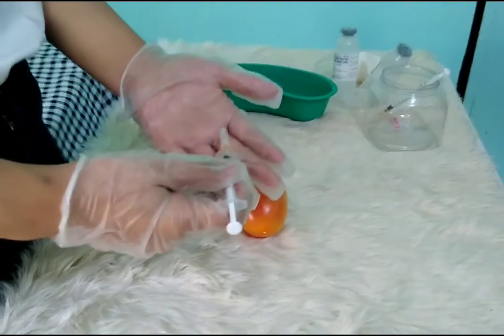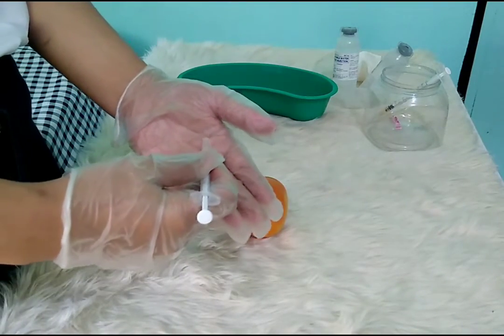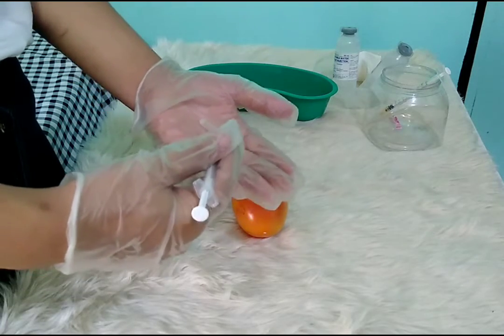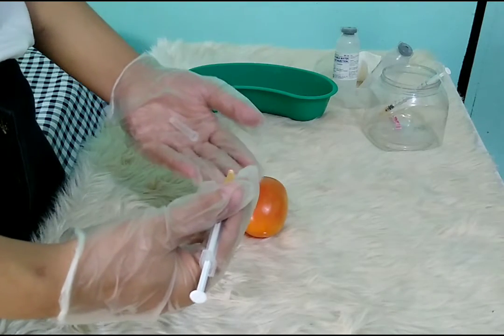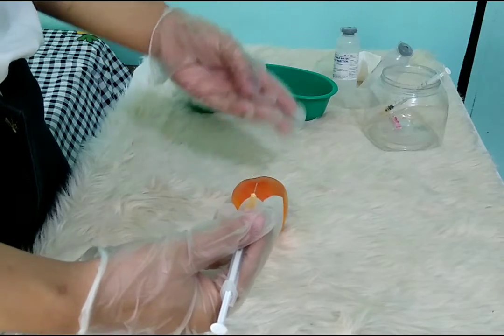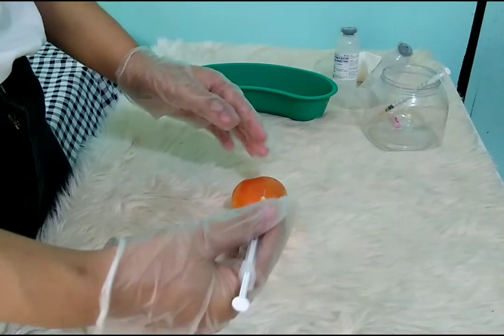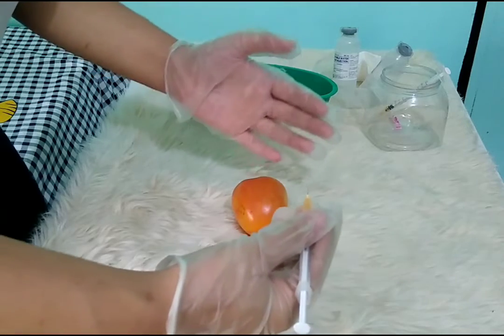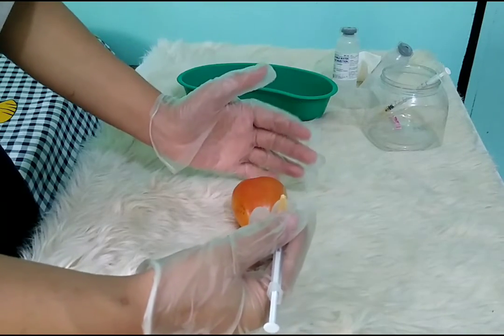Prepare the syringe for injection. First, remove the needle cap while waiting for the antiseptic to dry. Pull the cap straight off to avoid contaminating the needle, outside the edge of the cup, and dispose of the needle cap. And now inject the medication.